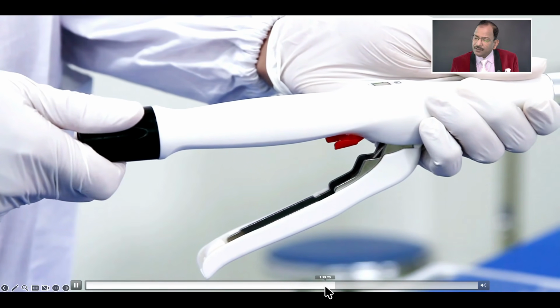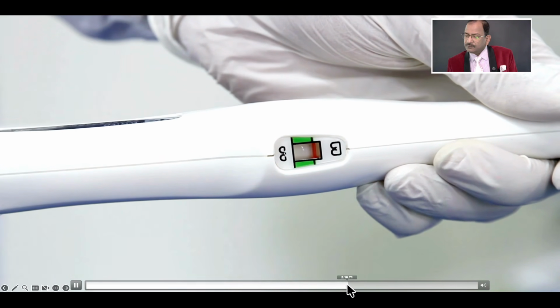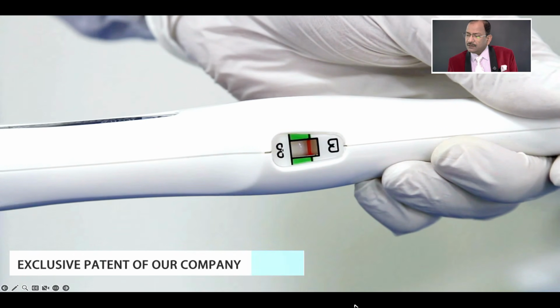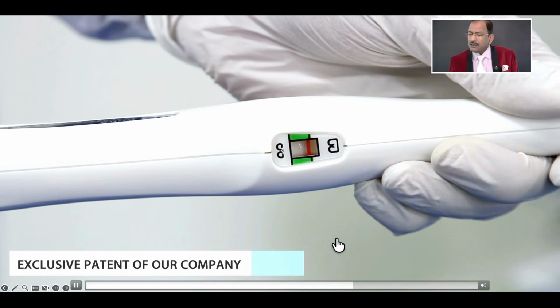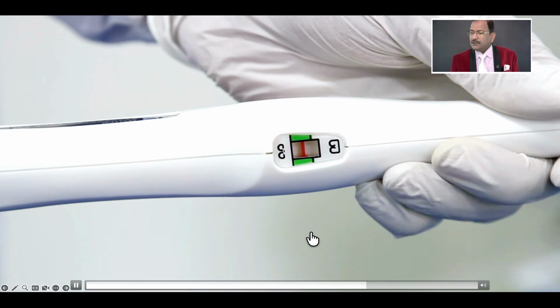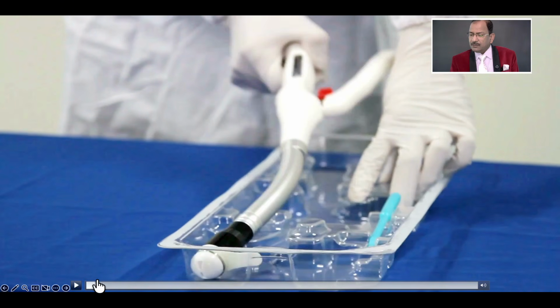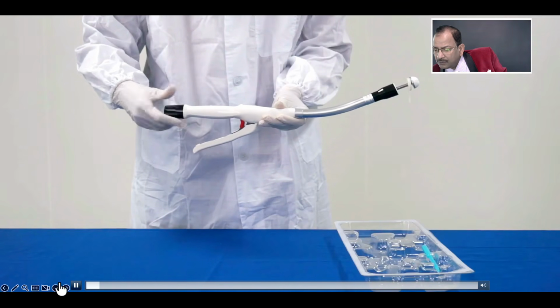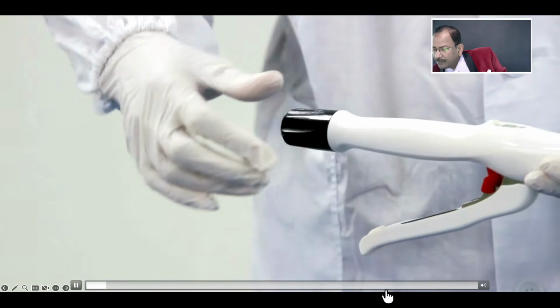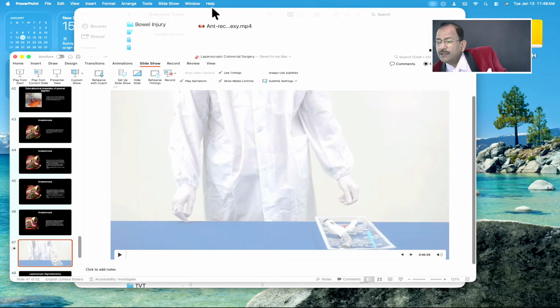Just 1 minute. So if you will see here, sorry, you will see here, let me, if you will see this, no, why is it not following my command? Just 1 minute. Let me open the video directly.